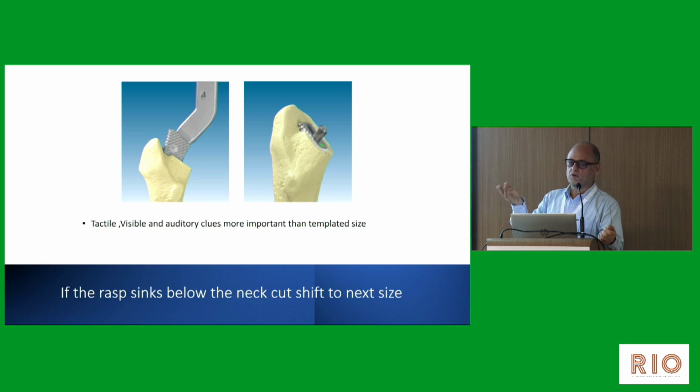So I always follow the lips of the acetabulum all the time. If there is good coverage on all the 360 degrees and your trial is still visible before you finally insert the cup, if you put your trial and see that it is still there, that means you have got adequate coverage and probably the adequate length. Beyond a point, we are all worried that we should have a good hold of the cup. But I think the conventional approach is that you should see punctate bleeders, and your fovea and the walls should be well merging, and a good coverage of the lips all around.